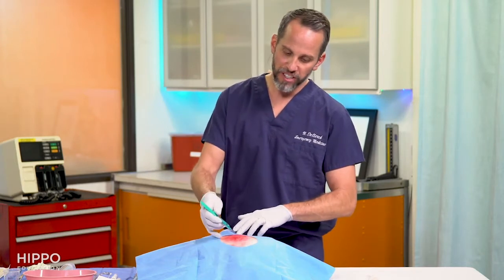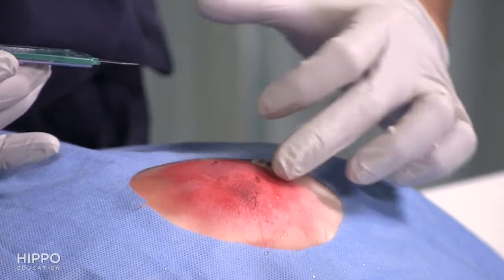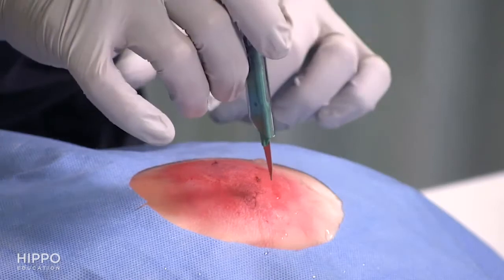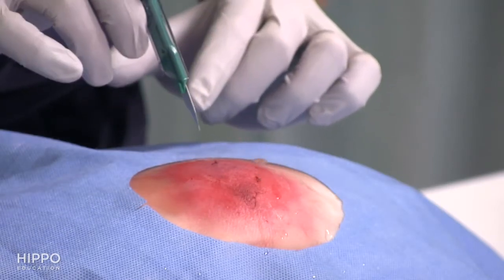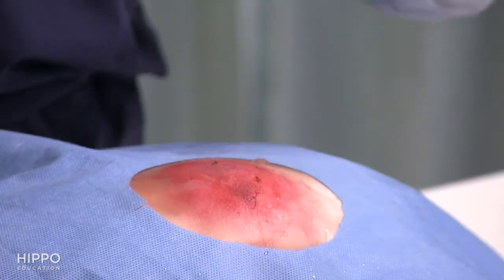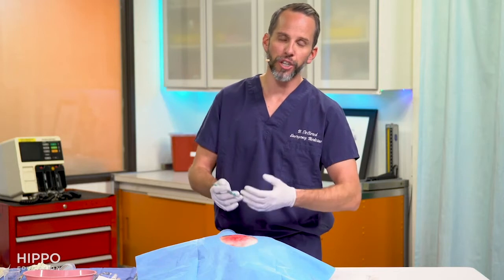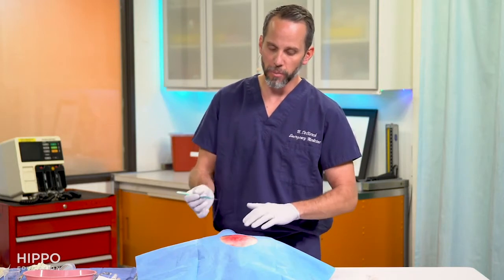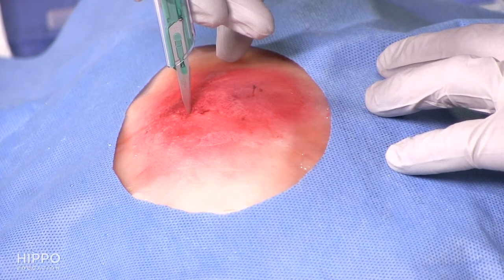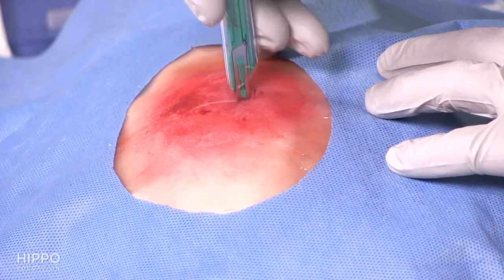The other thing is when I make this incision, you want to try to make it along the entire abscess. When I'm feeling the fluctuance on this, I can feel that my abscess pocket, I'm guessing, is between here. So when I'm making my cut, you really want to take advantage of that and open that up. You never want to just make a small hole and try to work through that hole. It's going to be very hard to access it. Opening it appropriately is going to be important. You obviously don't want to make a huge laceration if you don't have to, but don't be too gentle. Now going over the area that you've anesthetized, you take that blade and make your incision.